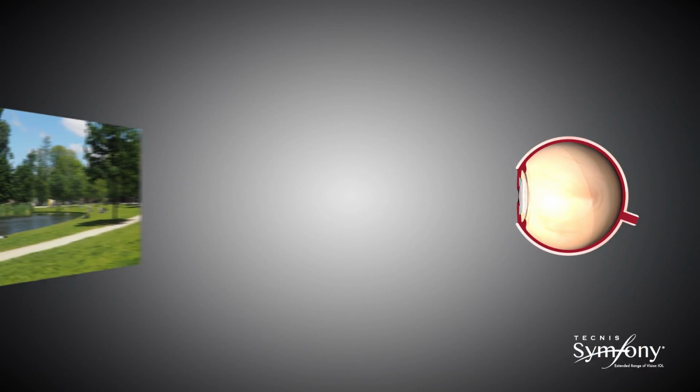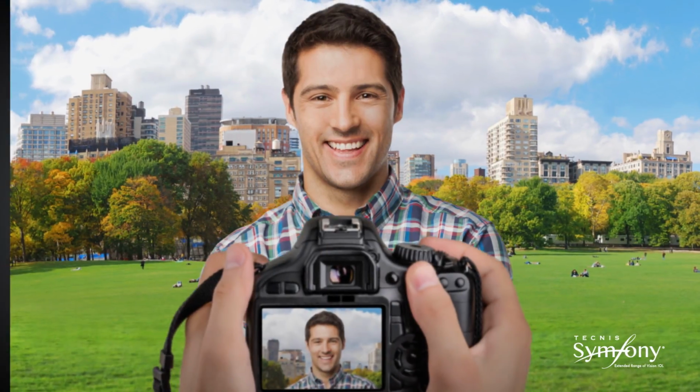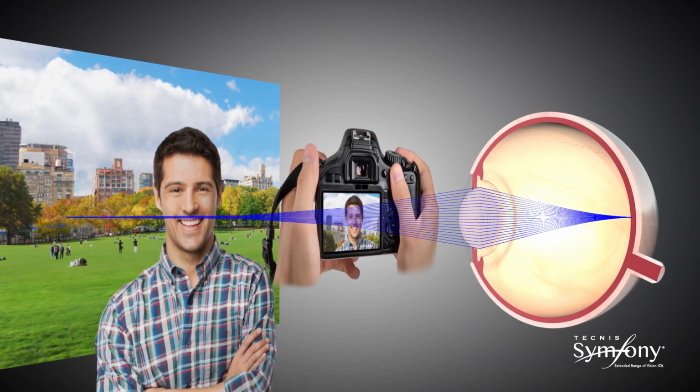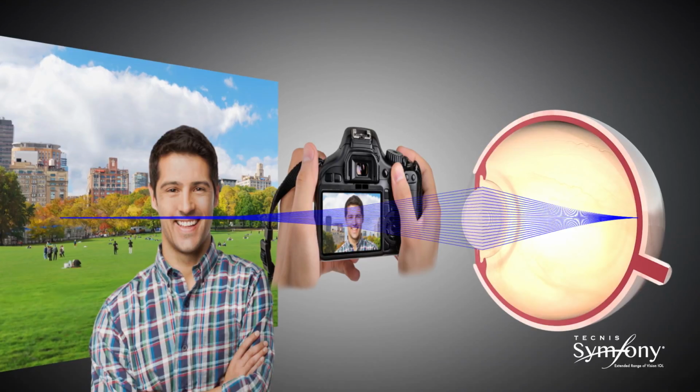In multifocal IOLs, diffractive technology transmits the light in such a way that it converges at more than one focal point. Tecnis Symfony diffractive lens technology is optimized to transmit light over a range of distances. This is called constructive interference and results in an elongated focus.